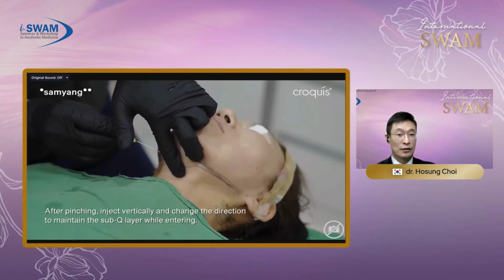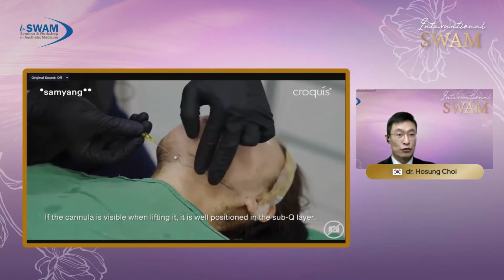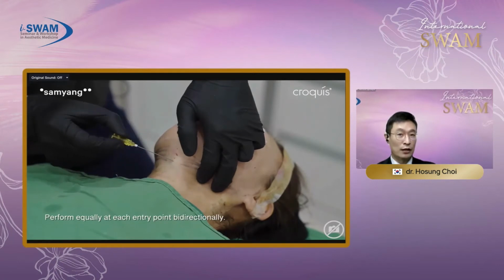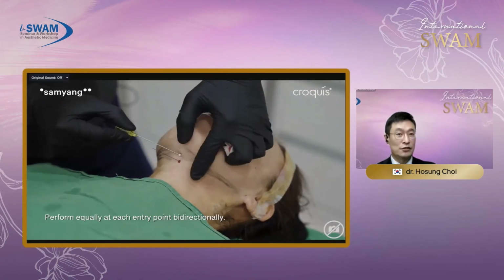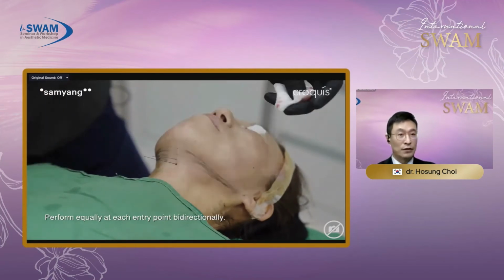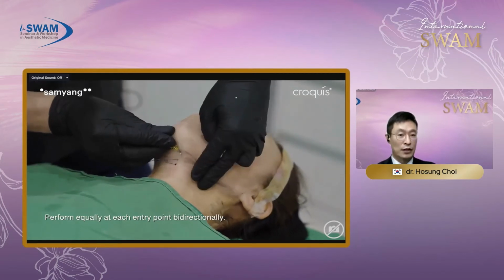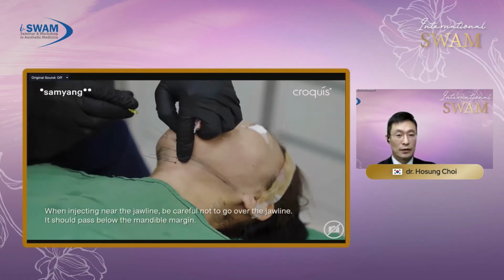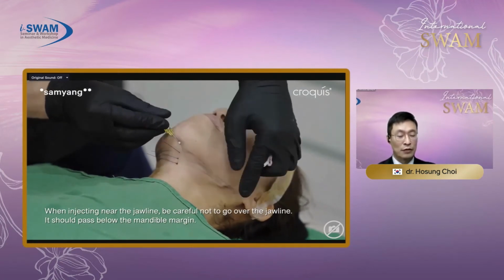And after inserting the tip of the cannula, you should be sure that the tip of the cannula is located deep enough, at the bottom of the subcutaneous fat layer, and then change the direction of the cannula parallel to the skin, and carefully advance. Go deeper vertically, and then change the angle horizontally, like this, because I will tie 2 threads at each entry point.